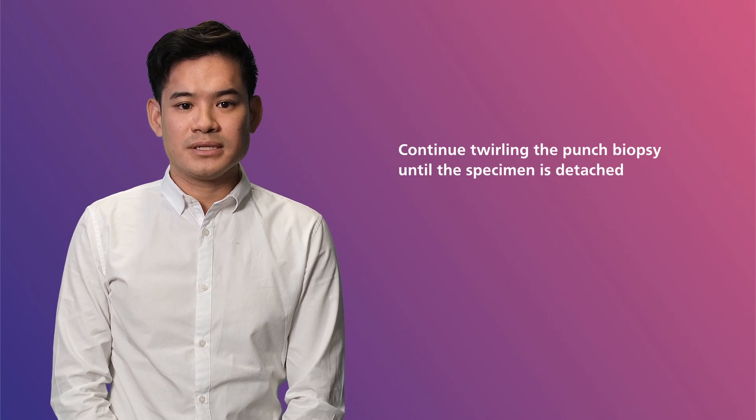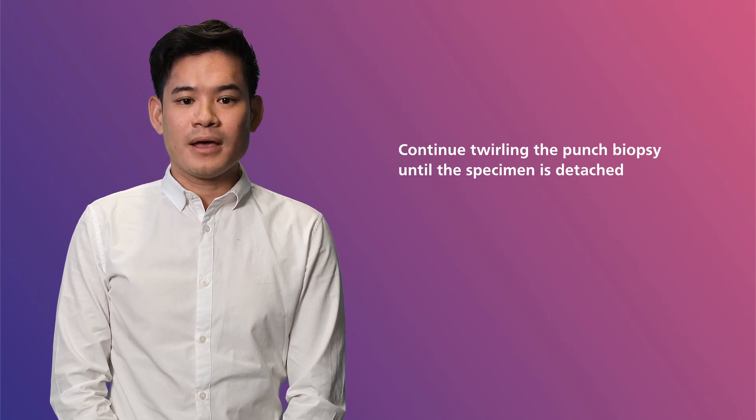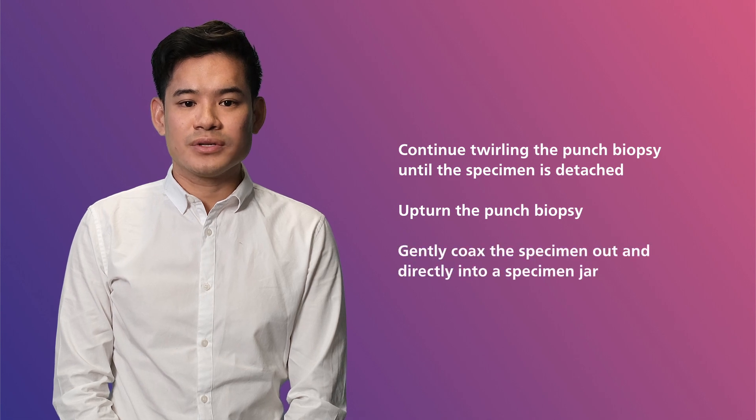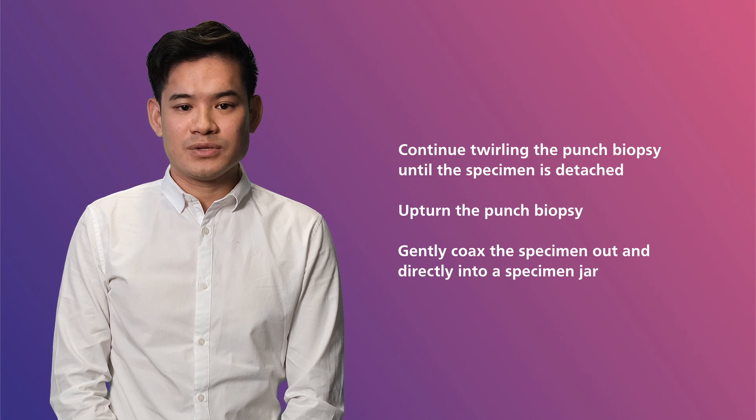Another technique you can use to safely deliver the specimen is to continue twirling the punch biopsy until the specimen is detached from the underlying tissue but still housed in the punch biopsy. Upturn the punch biopsy, then using a sterile needle, gently coax the specimen out of the punch biopsy cylinder and directly into a specimen jar.